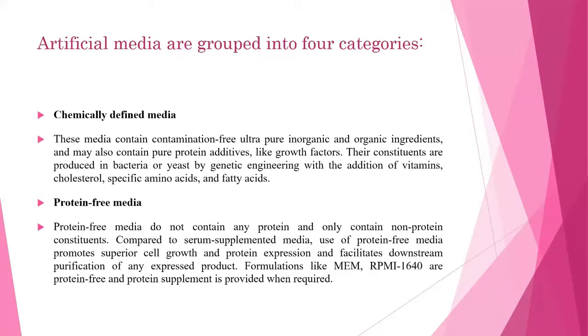The other category is chemically defined media. So chemically defined media, mainly that's because you want to have a medium which is contamination free. Okay, and you have to add these ultra pure inorganic and organic ingredients, and may also contain pure nutrient additives. Okay, growth factors and nutrient additives. Only thing is, you should make 100% sure that these are very pure forms. Okay, and these constituents are produced in bacteria or yeast by genetic engineering, with addition of vitamins, cholesterol, specific amino acids, and fatty acids. So they are generated outside and they are added. Only thing, they are contamination free.